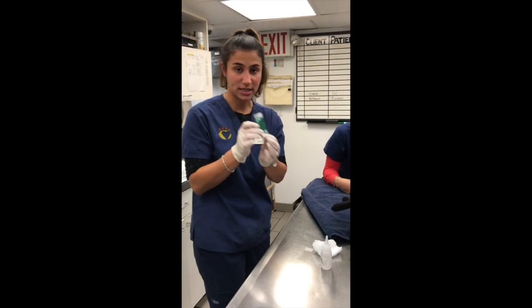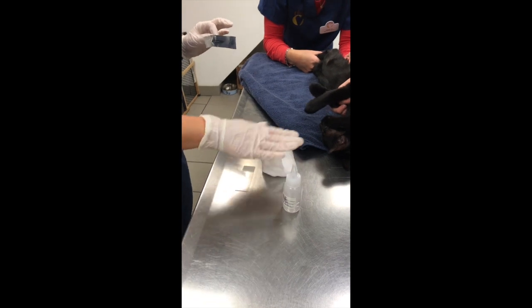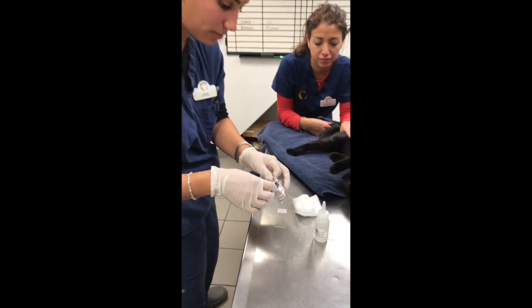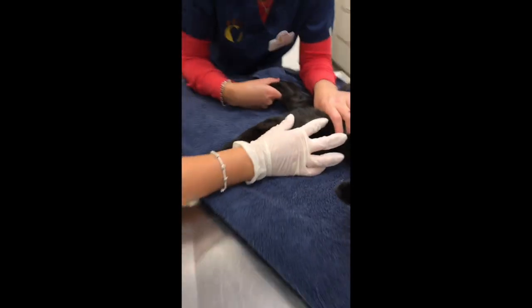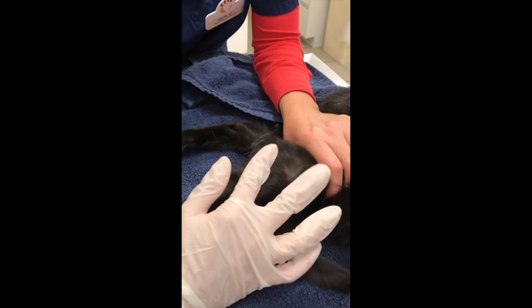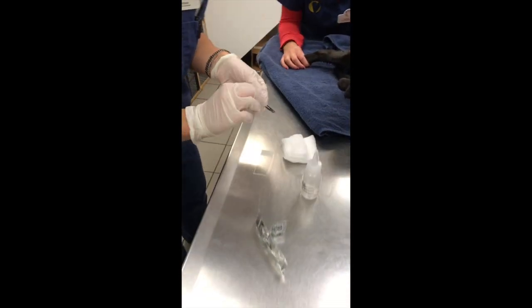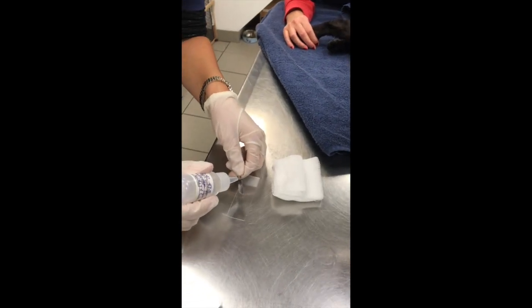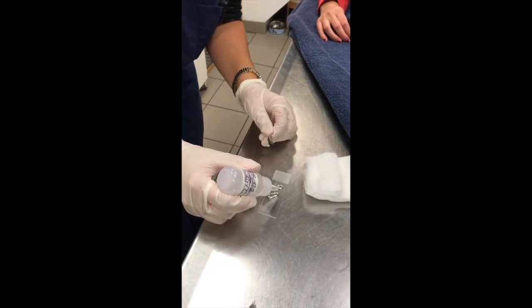The objects I'm using today are a 10 blade, a microscope slide, our mineral oil, and some gauze just to drop the mineral oil. So I have our 10 blade here. The area I will be scraping is right here near his leg, where he's really been itching and scratching. Oh, I know, Benny. First I'm going to put mineral oil on our blade, and then some on the slide.